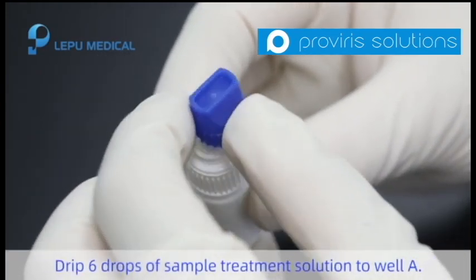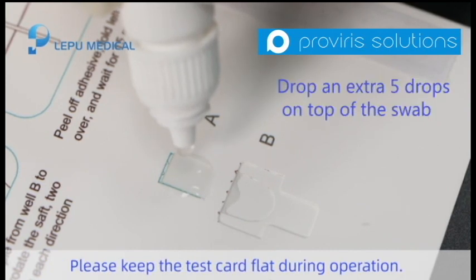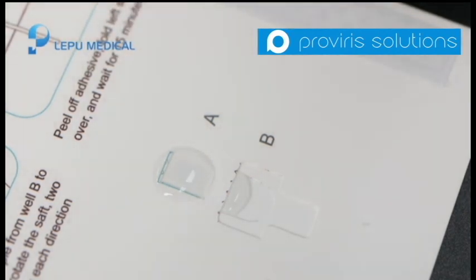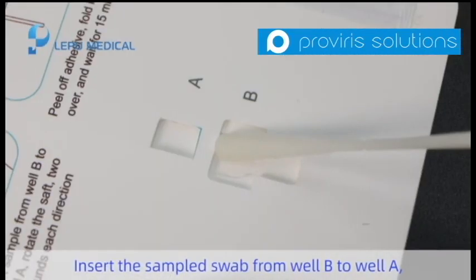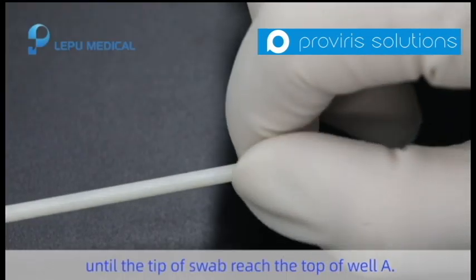Drip 6 drops of the sample treatment solution into well A. Please keep the test card flat during the operation. Insert the sampled swab from well B into well A until the tip of the swab reaches the top of well A.